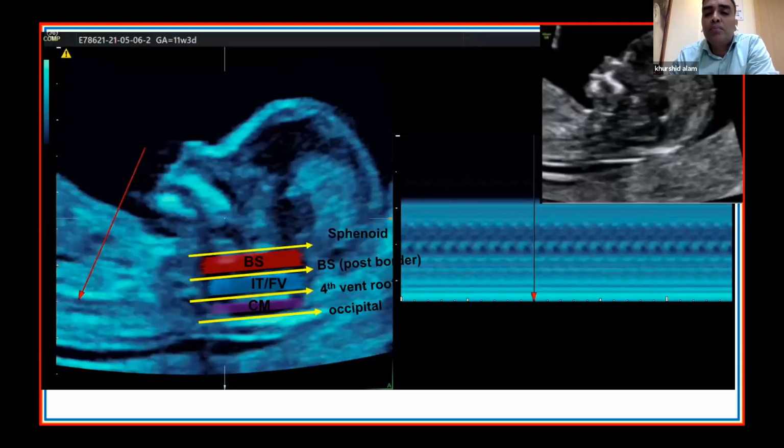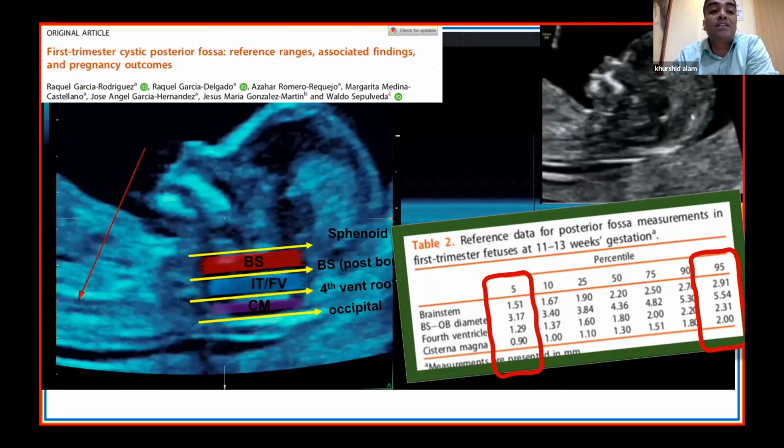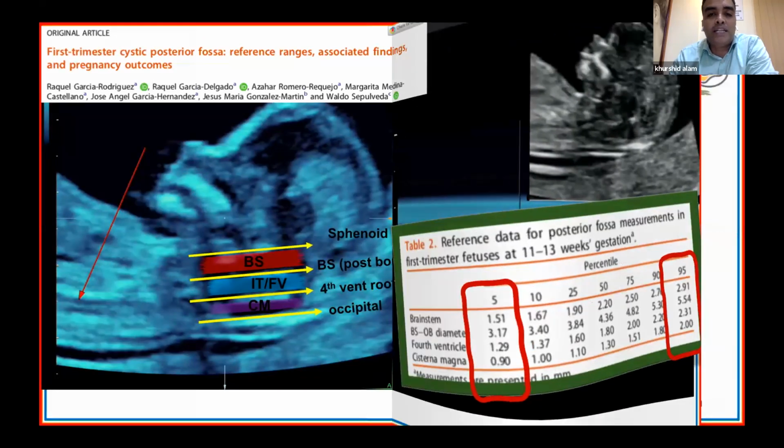So this is a very important concept for all of us to remember. There can be two ways which we can do. One is pattern recognition, that is a subjective approach. The other is the objective approach, where you can look at these nomograms, which have been recently given by the Valdo-Sepulveda group in 2019. Either of them works, but I would recommend that pattern recognition is good enough, and then you can interrogate the spine directly to confirm your findings.